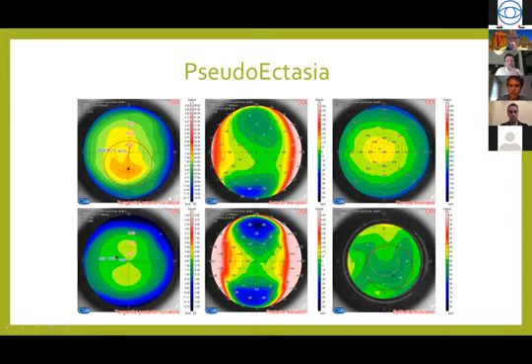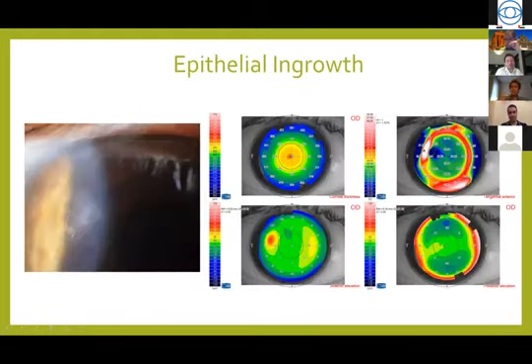Okay, so this is not a real ectasia, and you can continue with refractive surgery, probably PRK, because of the overall thickness of the cornea. So this is just a thin cornea, but not a pathological cornea. But also, with this new way of identifying and diagnosing the cornea with epithelial images, we can now see things as we have never seen them before.